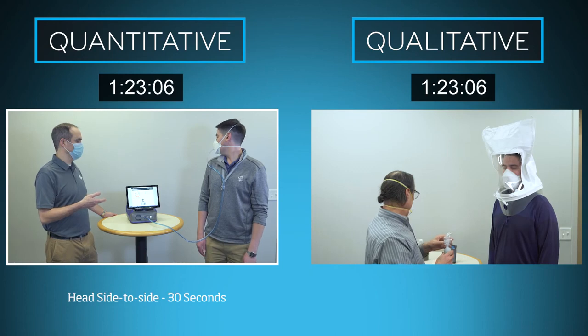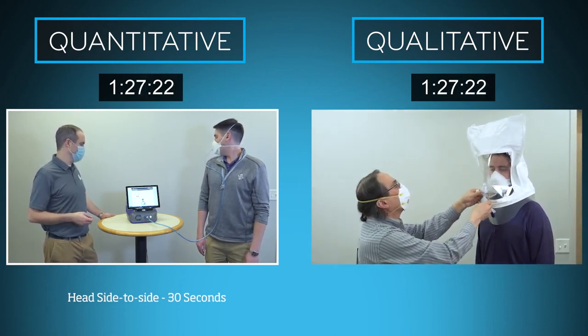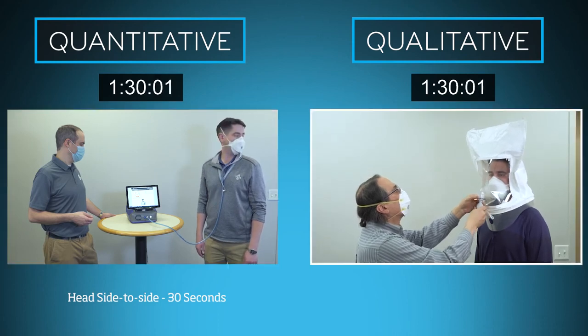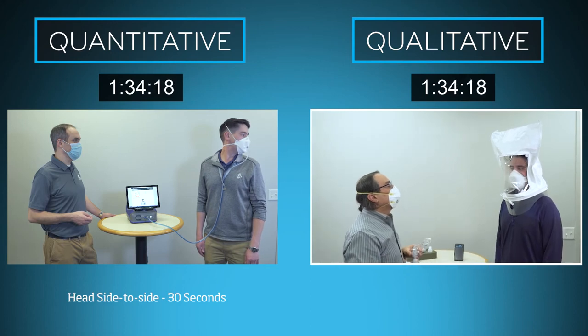Here, we move on to the third exercise for the quantitative fit test, 30 seconds of head side to side with 2 breaths at each extreme. Meanwhile, the qualitative fit test needs an additional 40 seconds to complete the second exercise.